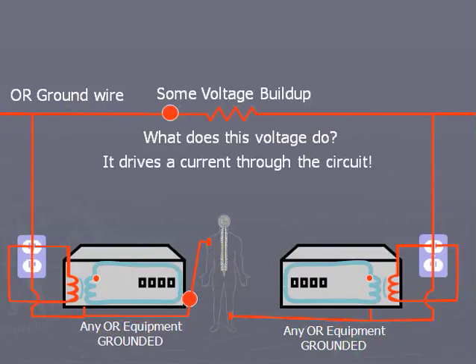One important note here. In this particular instance illustrated, would it matter if the equipment was even on? No. As long as the ground connections were applied to the patient and the equipment was plugged into the wall outlets, this ground loop could occur whether the equipment was on or off. Another important note here is that the ground electrodes connected to the patient in this instance are actually connected to ground at the wall outlet through the equipment. As we will see in the next slide, that is not always the case.